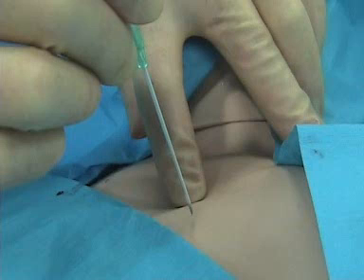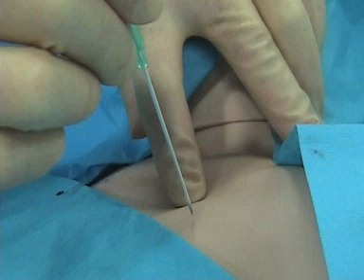You see how I'm putting that needle in here — straight down? That's what you would not want to do. Do not do that when you are putting in a subclavian. You always want to keep it parallel. Parallel.